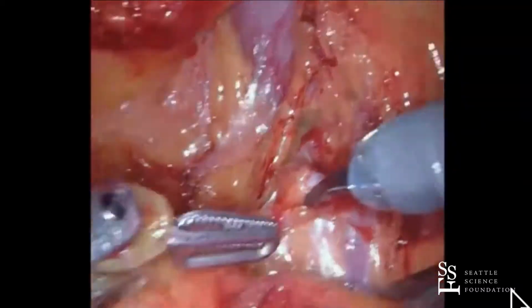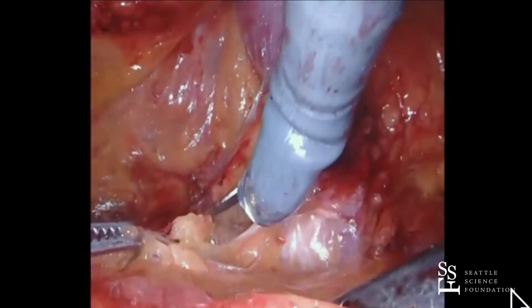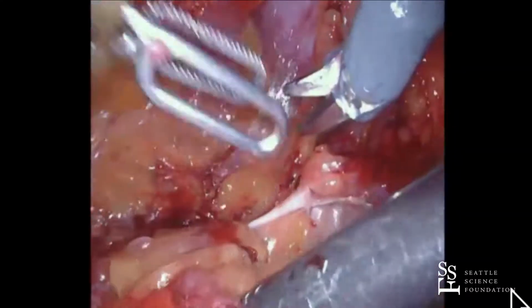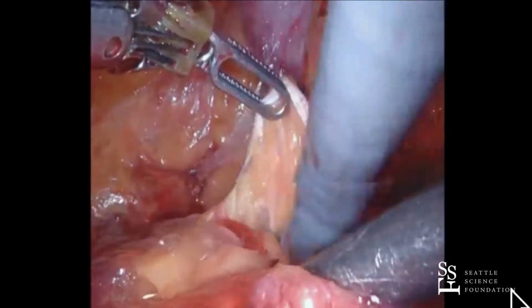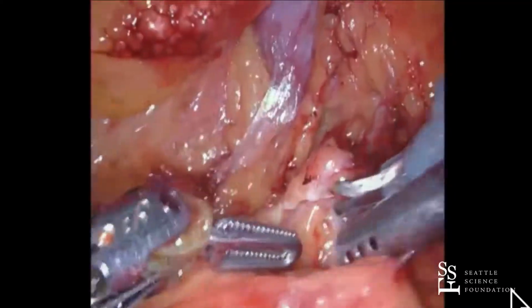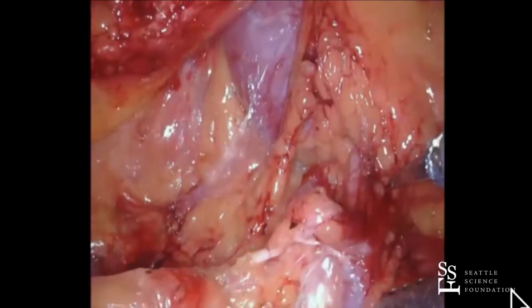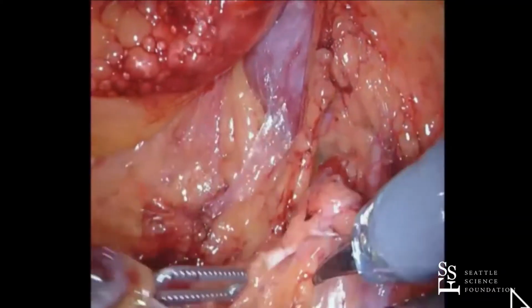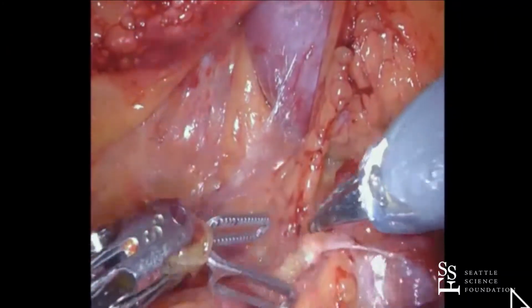So I think you guys saw from the 3D model that there was an early bifurcation of the artery. I don't know if you appreciated that or not. Yeah, absolutely. But the model, I think, really showed that nicely. I think better than I saw it on the scan for sure. So here's one branch. Here's the other branch. That means the main trunk's going to be down here. And interestingly, I don't know if you noticed in the model, but it looked like the branch was behind the cava.